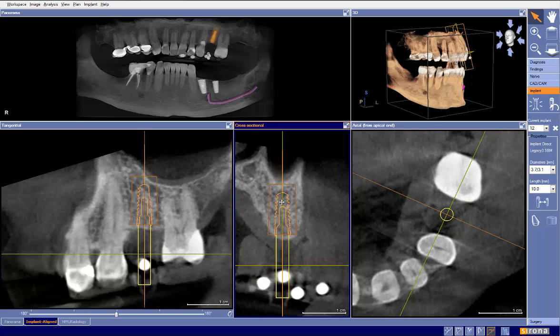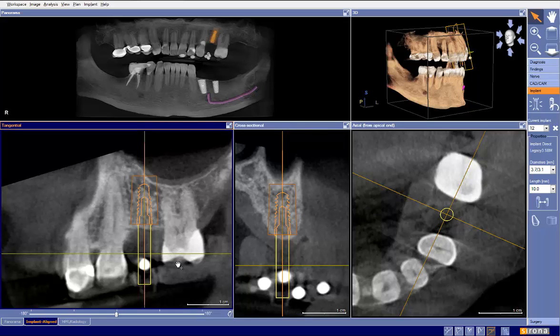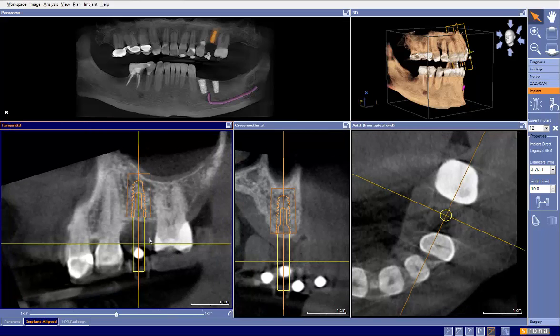And now there we go. So now we're centered in the occlusal plane of the tooth here. Just cheat a little bit more there. Great. Now the next thing we were taught to look at was our occlusal plane. Now we've looked at our occlusal table, it looks very good, and now our occlusal plane. Now, why aren't we seeing more teeth here or seeing this a little bit better?